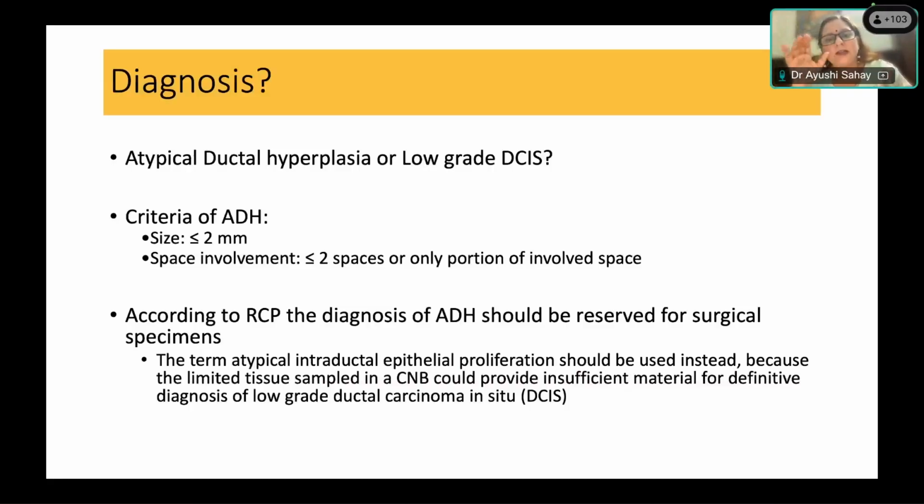So the importance is that if you have a papillary neoplasm and you're not able to give a straightforward diagnosis of intraductal papilloma, and you do not have IHCs or any kind of adjunct support, then you can give it as a papillary neoplasm or complex papillary proliferation, and advise these markers to be tested before going ahead with definitive excision.